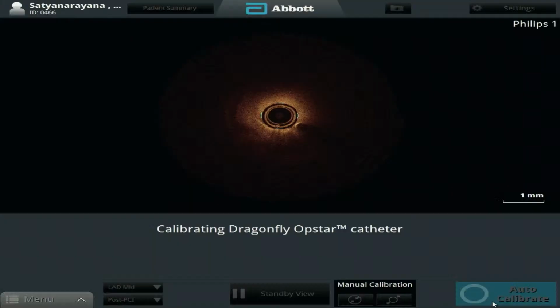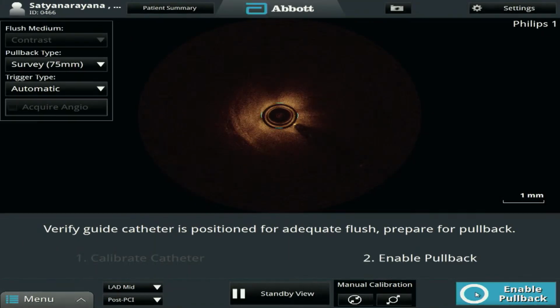You are beyond the, brother, you are unable to see stent struts, no? So we are beyond the stent struts. Now engage properly. Check once. If needed, slightly push it. Small test. Now slightly push it, not engaged.